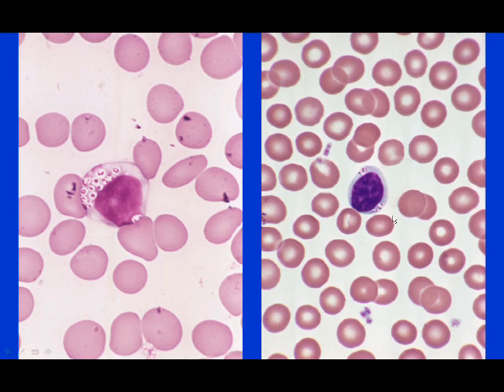More subtle on the right, we see just dots of mucopolysaccharide inclusion, and these actually look like those you might see in a large granulated lymphocyte. The difference being they're all in kind of a lacunae of clear area around the granules.